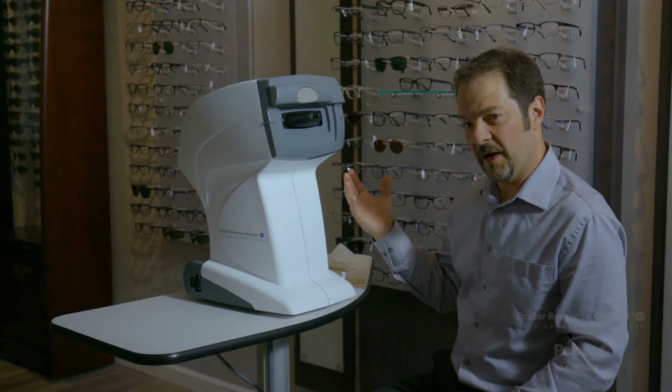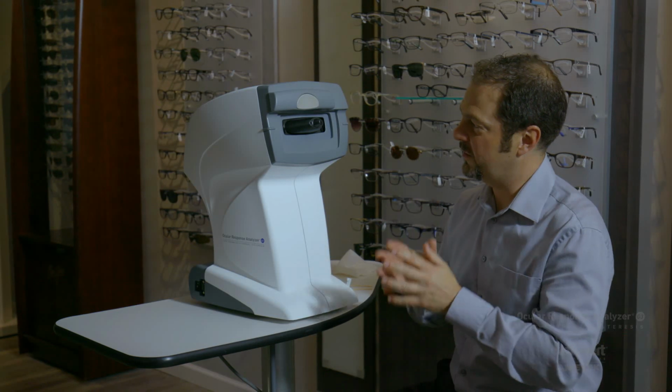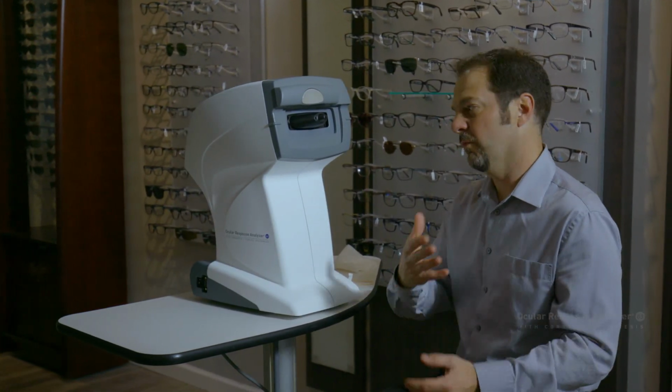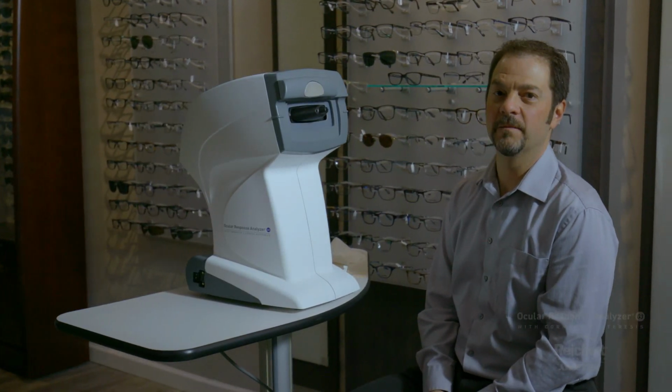You're going to go around to the back of the instrument. You're going to say, I'm finished cleaning. There's a little check button, and that's going to fire the air puff 3 times to make sure it blows any lint or debris out of the air tube, and retract the head back to its home position, and now you're ready to measure again.